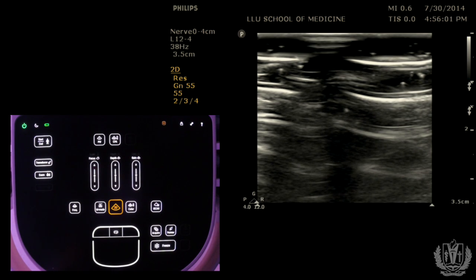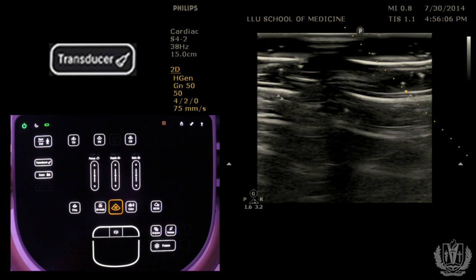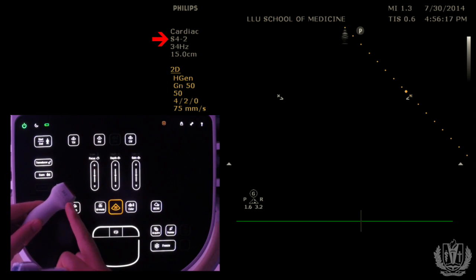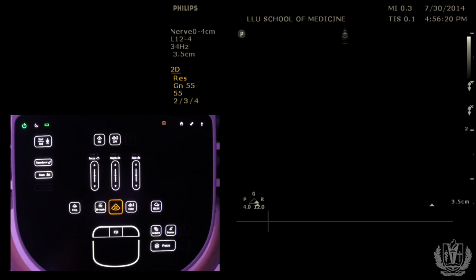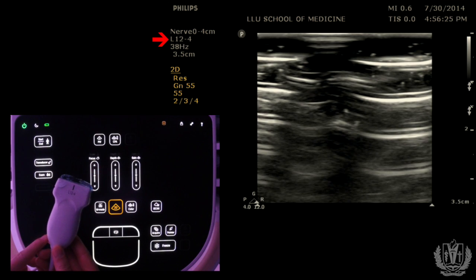The first thing you want to do is select the correct transducer. Right here where it says transducer, when you push that button, it changes the transducer. If you look at the top left of the screen where it says S4-2, that is the type of probe. If I push the transducer button again, it goes to L12-4, which corresponds to the L12-4 transducer.